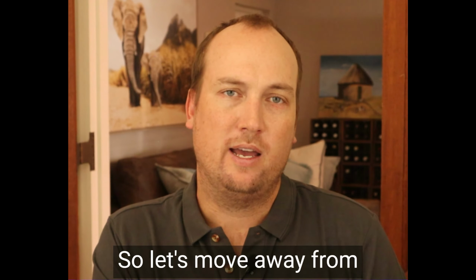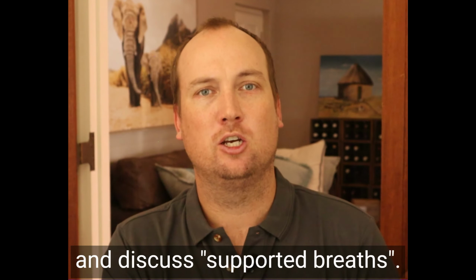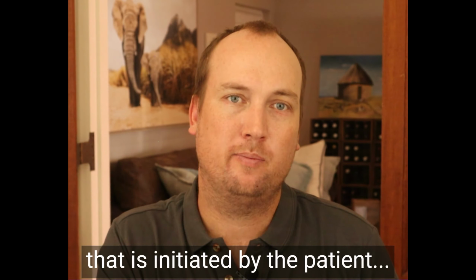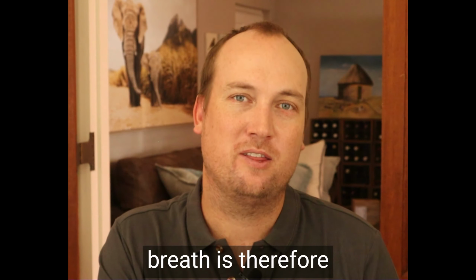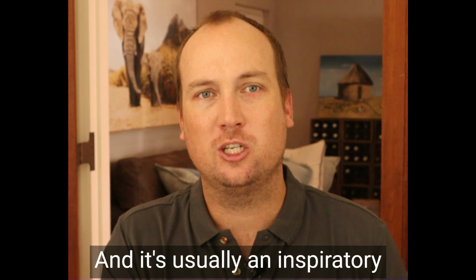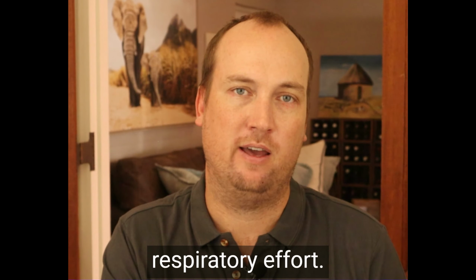So let's move away from mandatory ventilatory modes now and discuss supported breaths. A supported breath is a breath that is initiated by the patient. The trigger of the breath is therefore generated by the patient, and it's usually an inspiratory flow from a spontaneous respiratory effort.